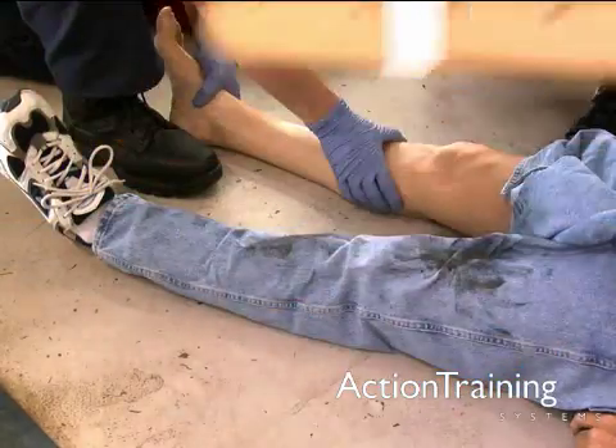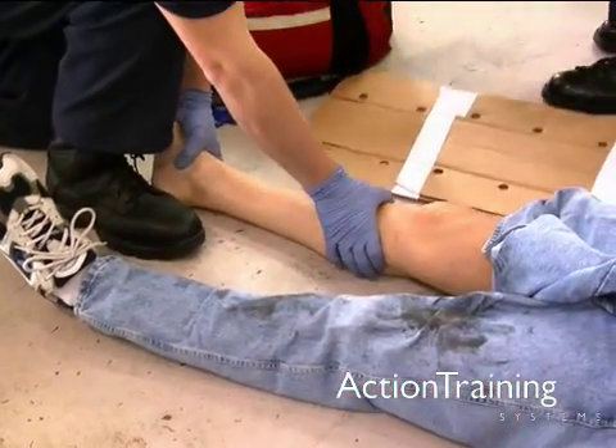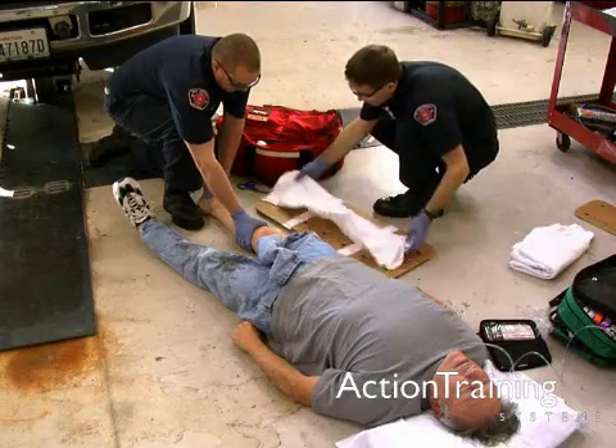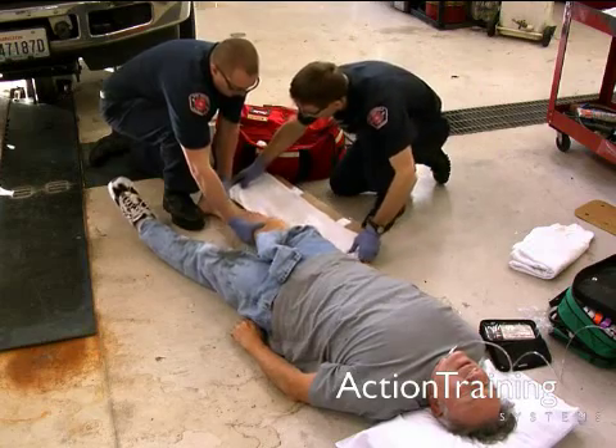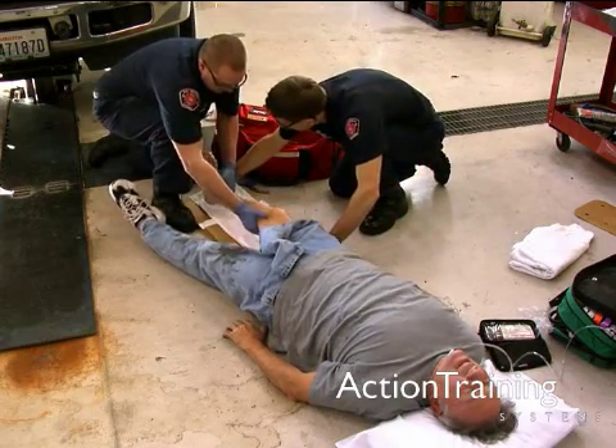Position the splint alongside the side of the limb where it will be applied. Prior to application, pad along the inside of the splint if needed to prevent discomfort and unnecessary pressure.